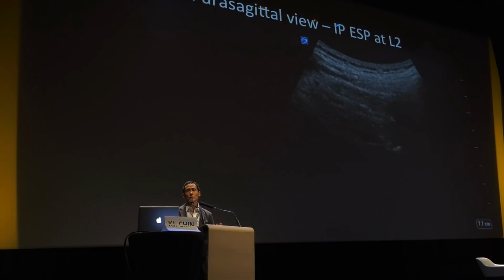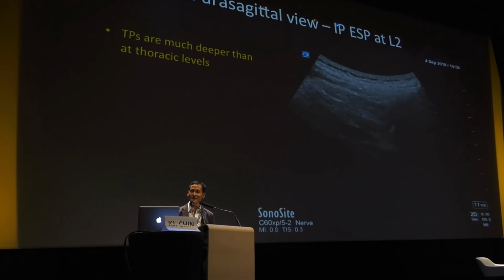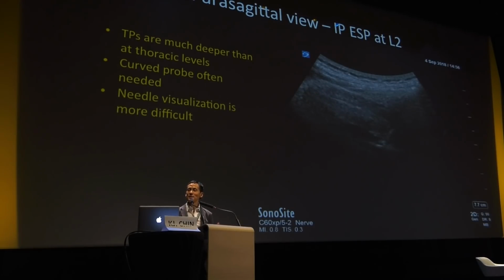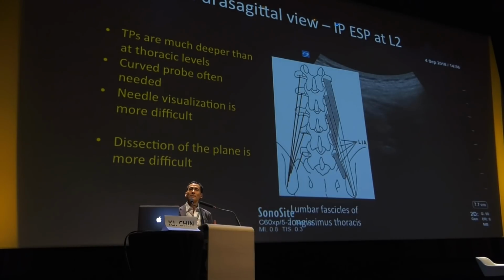One of the problems, however, with doing it at lumbar, or at least it's a problem in our Canadian populations, is that you can see that things are a lot deeper, all right? And so you often need a curved probe to be able to see your anatomy clearly. The needle visualization, as you can see here, can be a little bit more challenging, so it becomes more of an advanced technique if you have anybody who's a little bit on the heavier side. And also what we find too is you don't necessarily always get this nice spread that I was showing you earlier on. And part of that problem is probably because of the way the muscles are constructed.